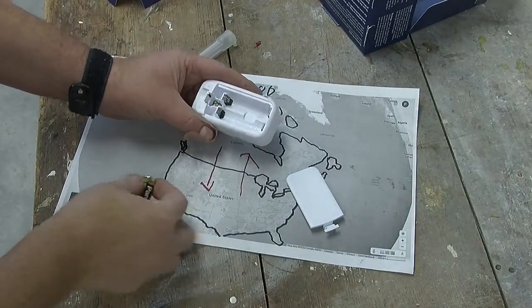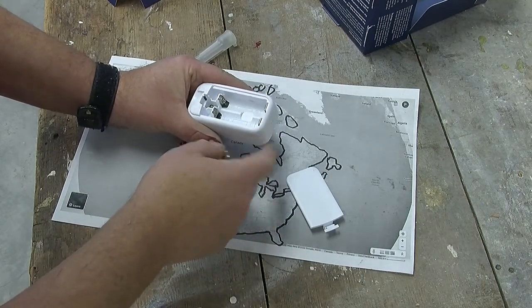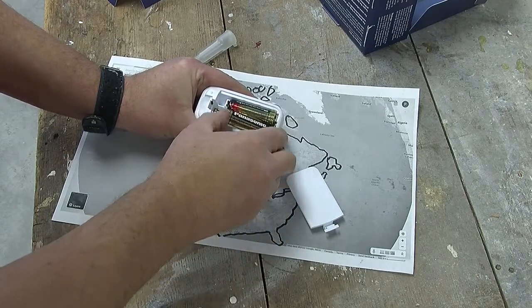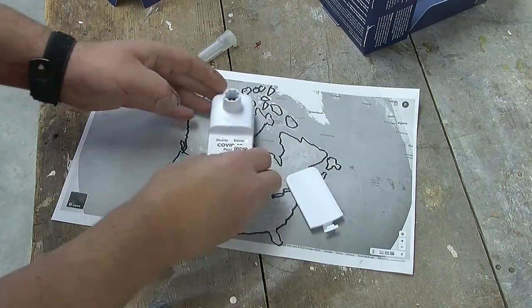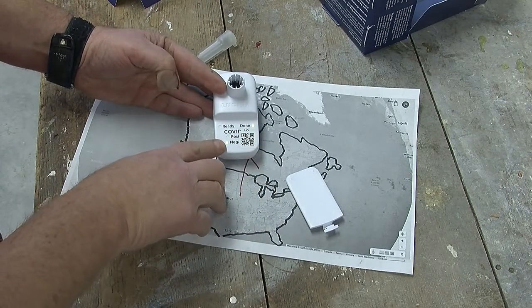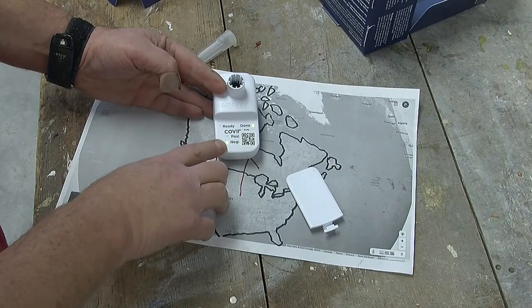Okay, so I've got some batteries in, and I should point out it's been about 6 weeks since I actually used the test, so who knows how that will affect how this module works. But anyway, the batteries are in. Does anything light up? Yes, it's still saying the test is done, and it's also saying my result is negative. So that's kind of interesting that it is still doing that.